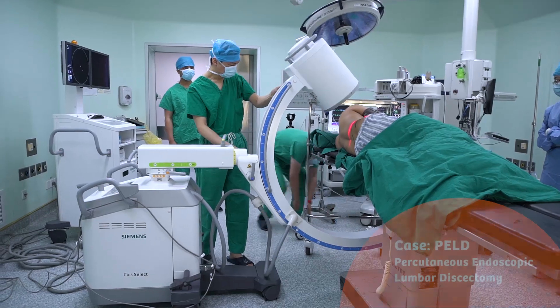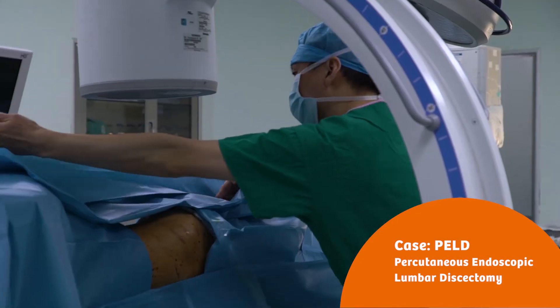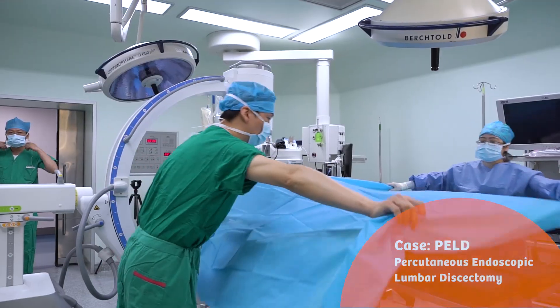My name is Xie Yu Zuan. I come from the Shanghai Nice People's Hospital. Today we have performed the percutaneous endoscopic lumbar disc surgery.